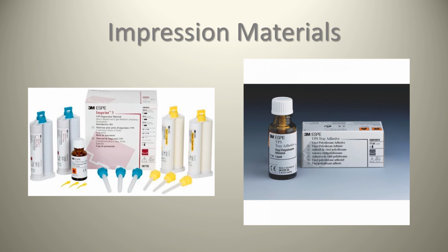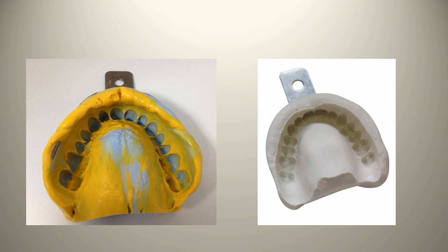So in this picture here, you can see some 3M vinyl polysiloxane impression material along with the appropriate tray adhesive, whether you're using a disposable tray or a custom tray, as we talked about previously. And in this picture here, you see a polyvinyl siloxane impression using light body, heavy body on the left, and the accuracy of the information that comes from that as compared to an alginate impression.